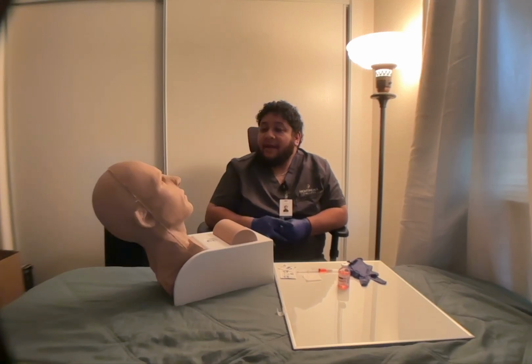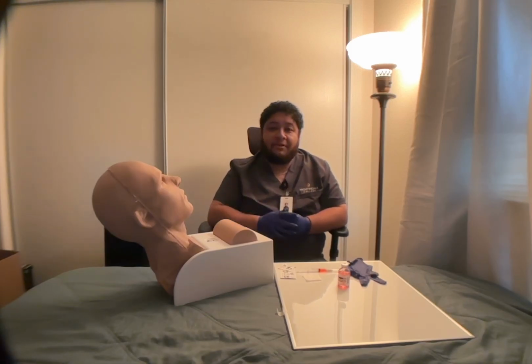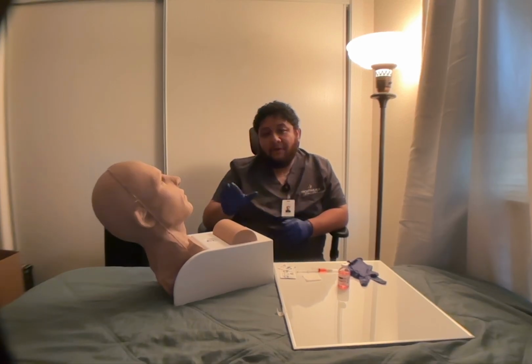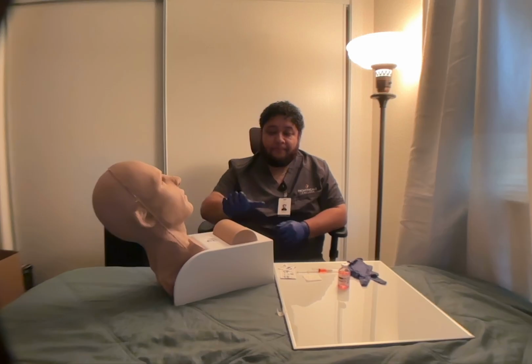Mr. John, is it okay to touch you? Yes? Okay, thank you. Now that I have permission, I'm going to place the heel of my hand over the patient's greater trochanter, and then I'm going to point my thumb towards the patient's groin. It has to be somewhat perpendicular.